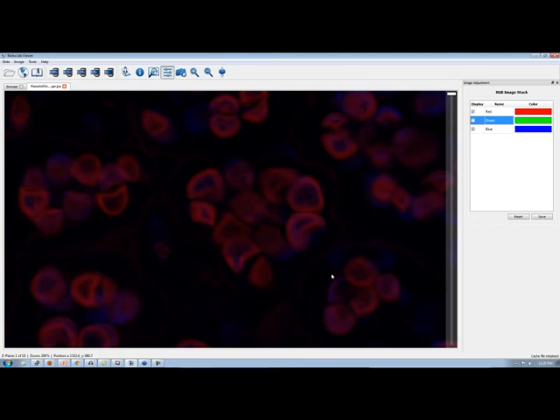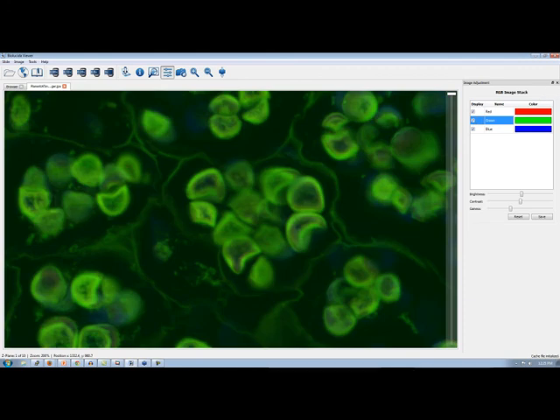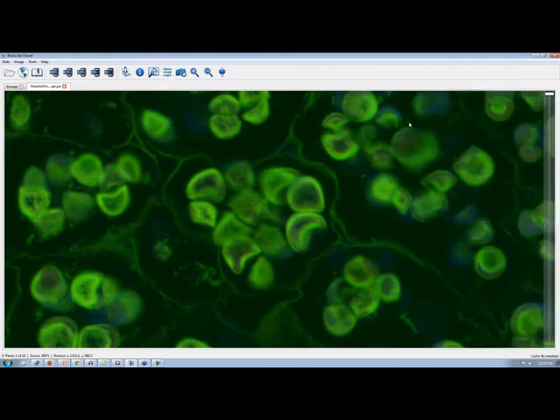I had a customer recently who requested a specific kind of situation that I thought Biolucida Cloud had a nice solution for. The situation was that this investigator had different genotypes and different age points, and they had virtual tissue of representative brain sections. Let's say they had 4 pieces of tissue, and what they wanted to do was meander scan and move around each piece of tissue simultaneously.